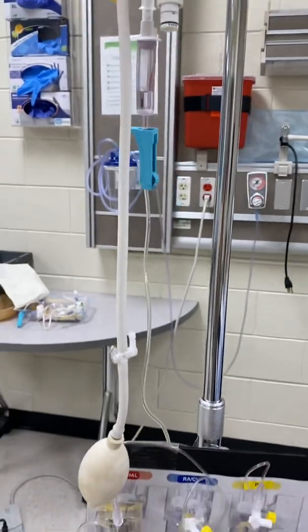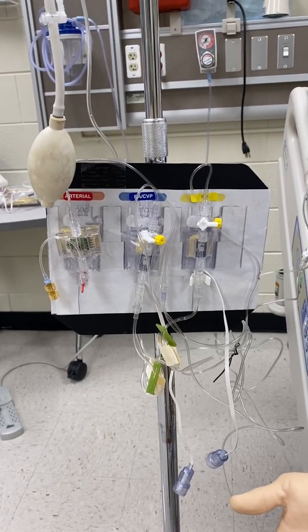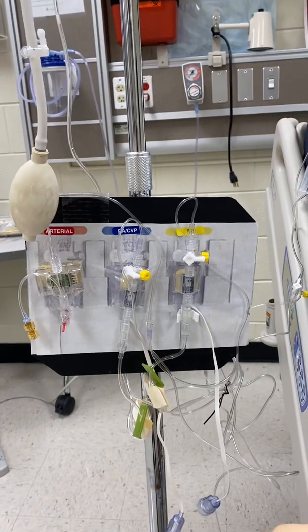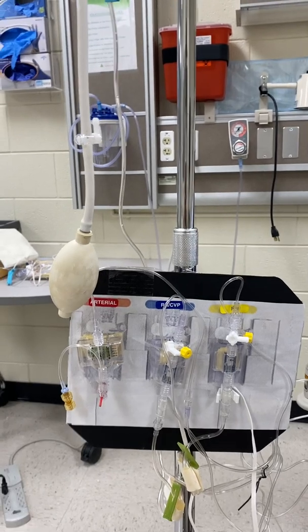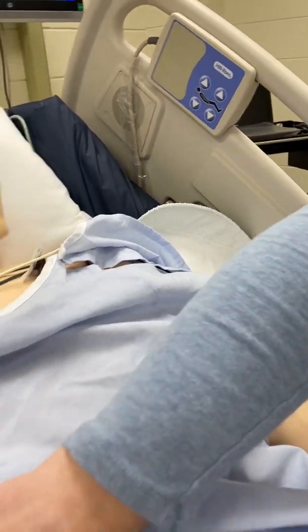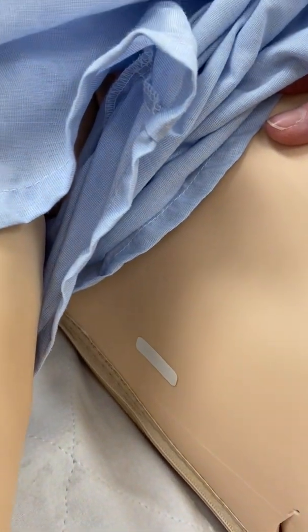And now here's our transducer holder, okay? Now remember, if we're going to do a CVP, or a pulmonary capillary wedge pressure, we have to find that phlebostatic axis, which Miss Zerbel and I have already done. So what I did is we counted down 4 intercostal spaces, and then we went to that mid-axillary line, and I wanted to show you that's how we marked it.